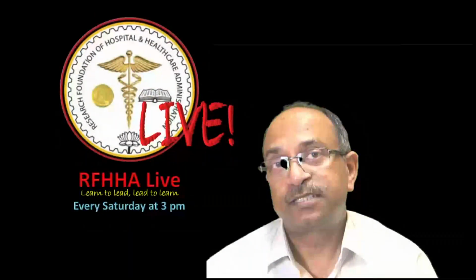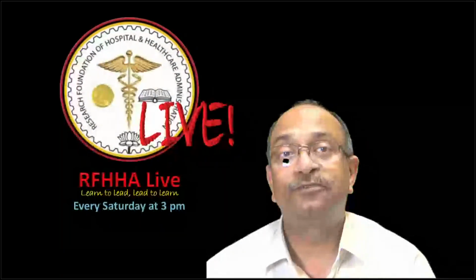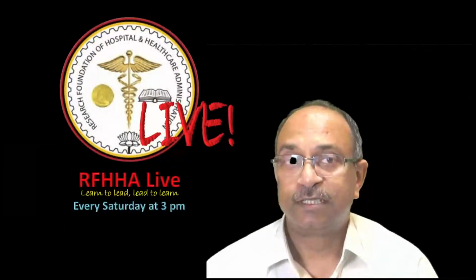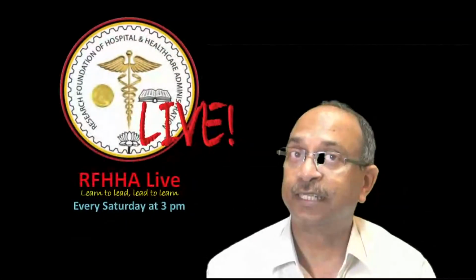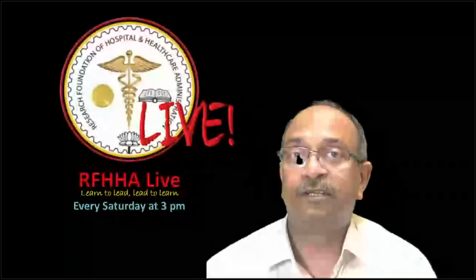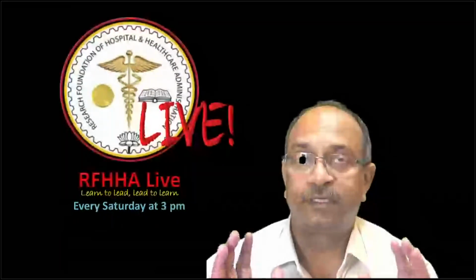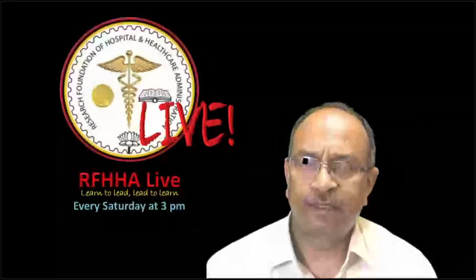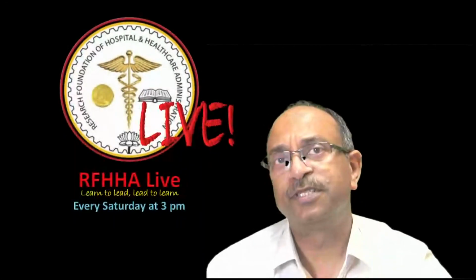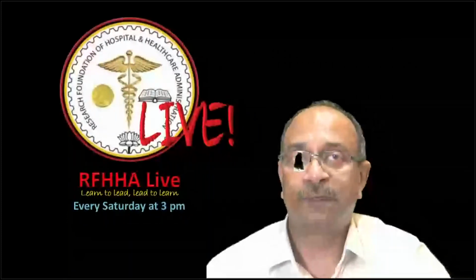Number three, all the alarms should be working at all times. This is a common problem. A lot of times you have a situation where the alarms may not be working, or if they are working, somebody has just unplugged those alarms. That is the reason why I have recommended that the power supply to the alarms should be such that it cannot be disconnected easily. So either you have a fixed power supply where there is no plug, or you have the plug and the switch secured inside a locked box, so that people cannot just disconnect the power supply. These are the important requirements, and otherwise the system is actually not very complex. It can be run very comfortably and easily.